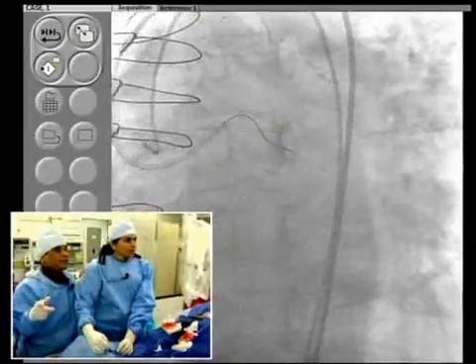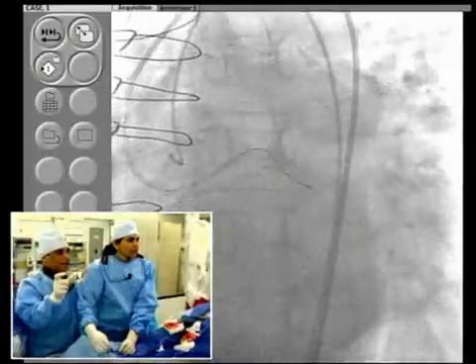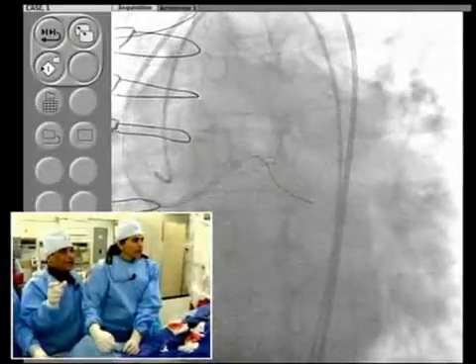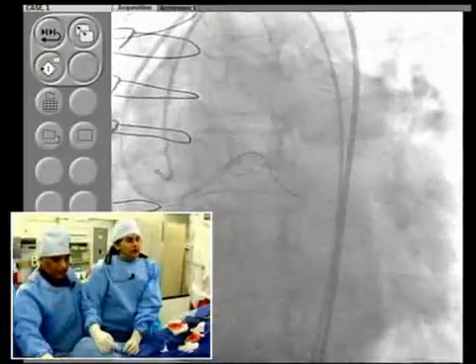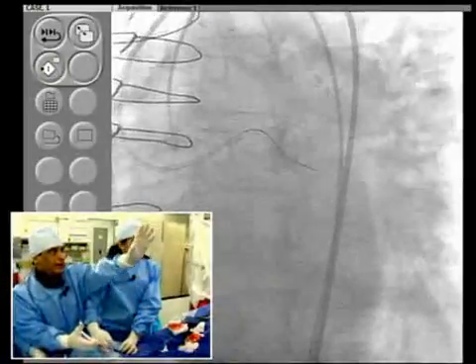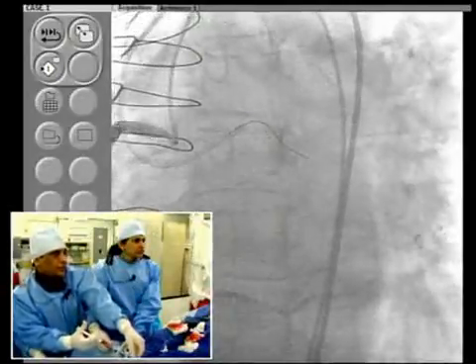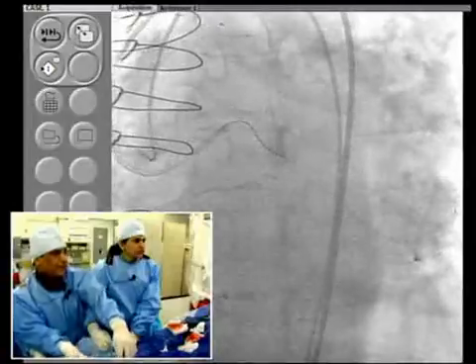Yeah. No, and then I think the LAD, again, as we said, that proximal LAD is supplying only the septal, and distal LAD, I'm not very happy. Talking about LIMA? Yeah, LIMA to LAD. The distal LAD through the LIMA. No, I'm saying that here, if we go from the left main, our goal should be to protect the circumflex, because that's a bigger vessel.